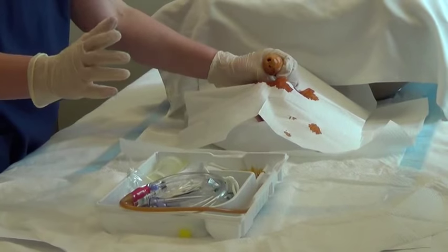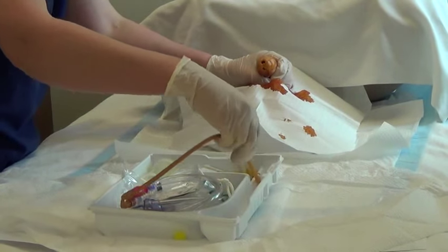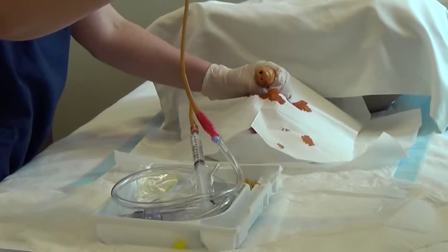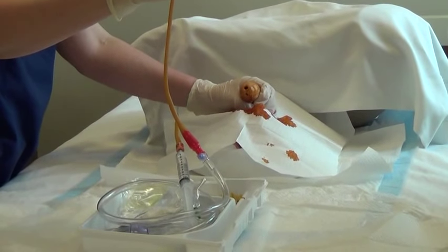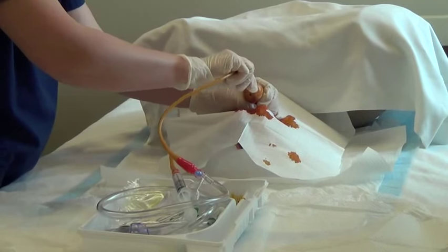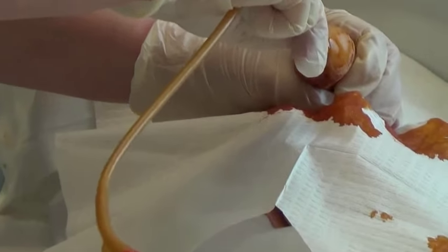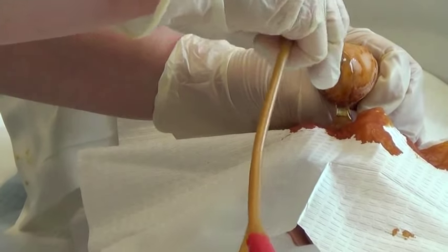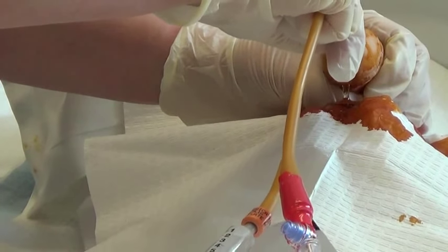After cleaning, remove the catheter from the lubricant. When using a coude for males, insert the catheter tip into the meatus with the curve facing toward the ceiling. Insert the catheter into the urethral meatus using gentle downward pressure until urine is seen in the drainage tube. Advance the catheter until the bifurcation.